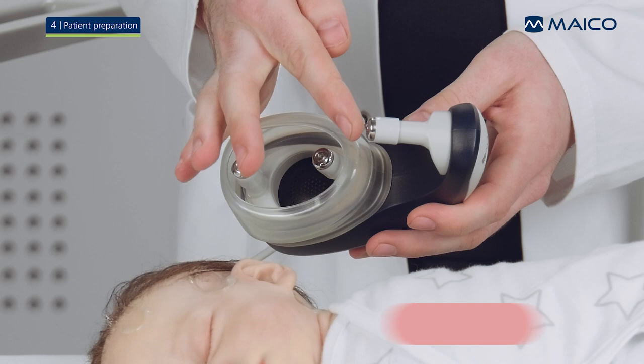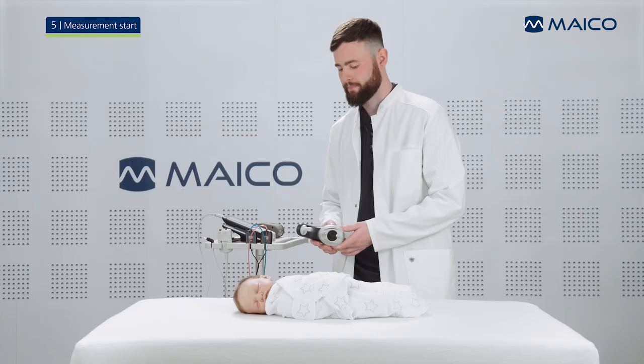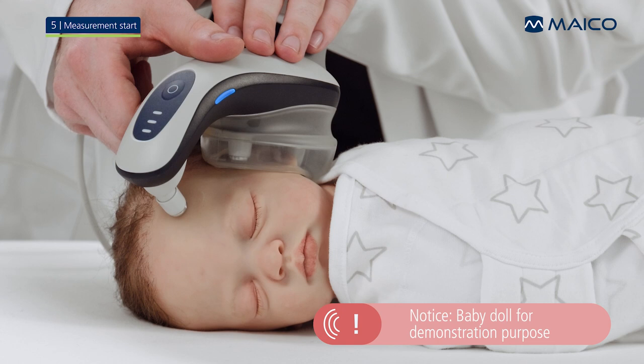Finally, place a small amount of gel on the electrodes of the Baraphone. Check if the correct ear side is selected on the EasyScreen — blue for left ear and red for right ear. Now place the Baraphone electrodes on the prepared electrode spots. Pay attention that the cushion surrounds the baby's ear without leaving gaps and that the electrodes have contact with the skin.